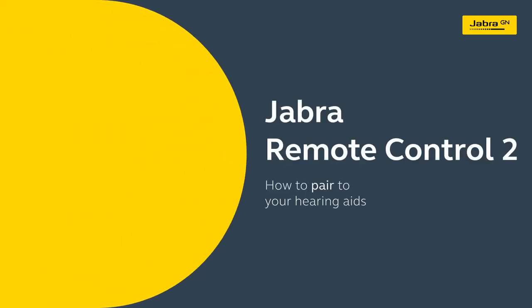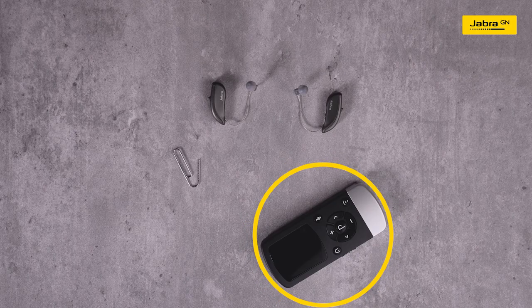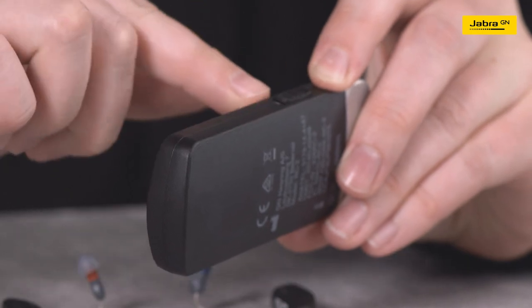How to pair your hearing aids to the Remote Control 2. Locate the Remote Control 2. On the side of the Remote Control 2, locate the power slider and turn it on.